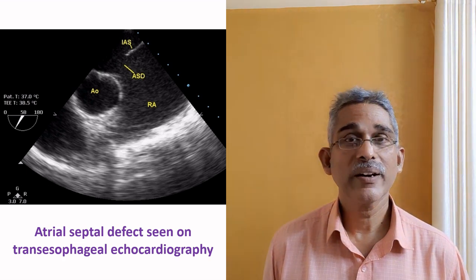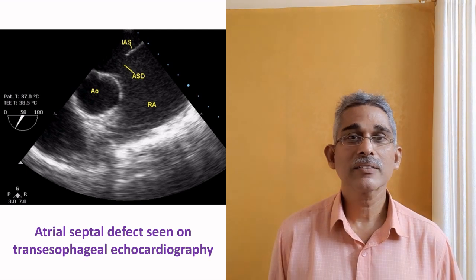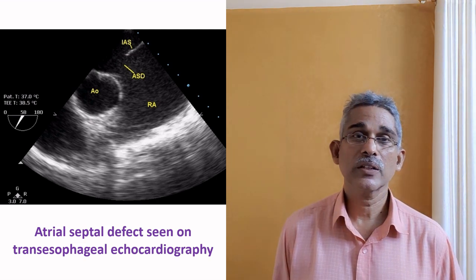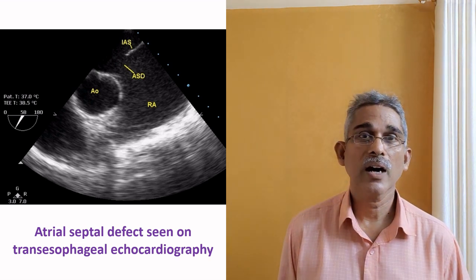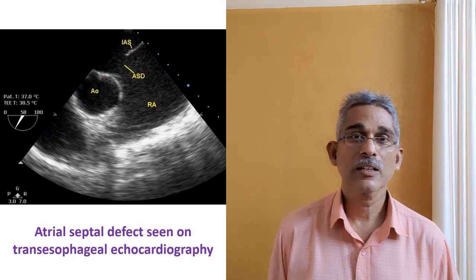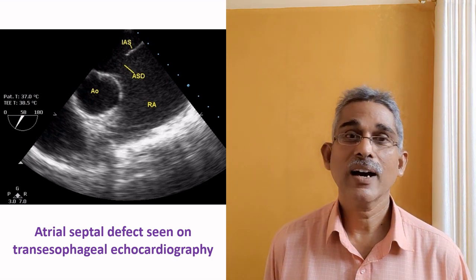For monitoring of left ventricular function during non-cardiac surgery, transesophageal echocardiography is an important method, and nowadays most advanced anesthesiologists use transesophageal echocardiography even for non-cardiac surgery to monitor the function of the heart, just as you have ECG and other parameter monitors during anesthesia. So several advantages are there for transesophageal echocardiography. The only disadvantage is that it is semi-invasive and the operator has a higher learning curve.